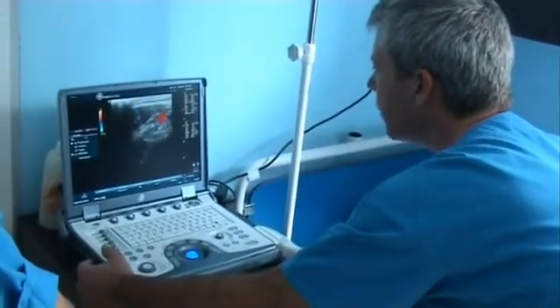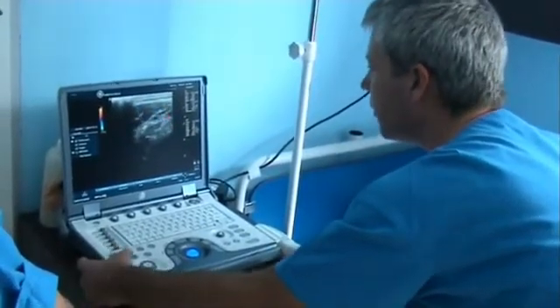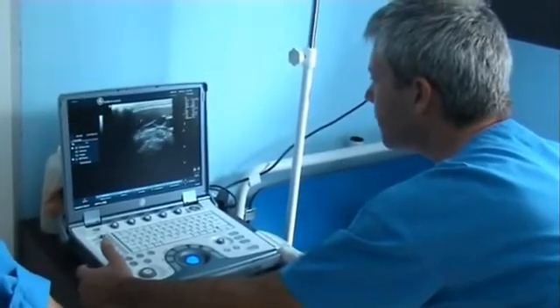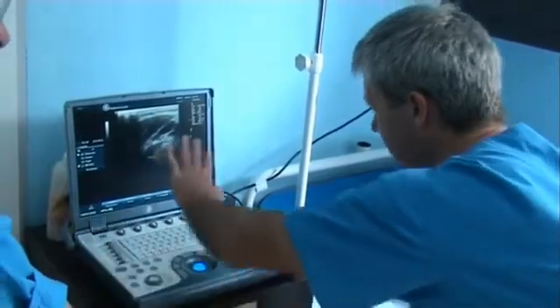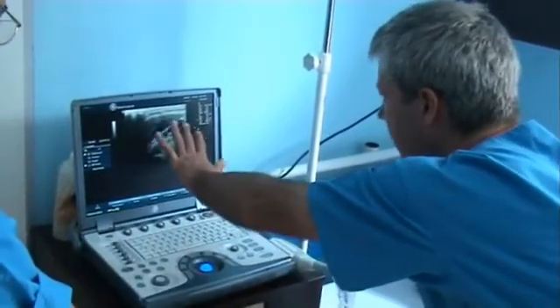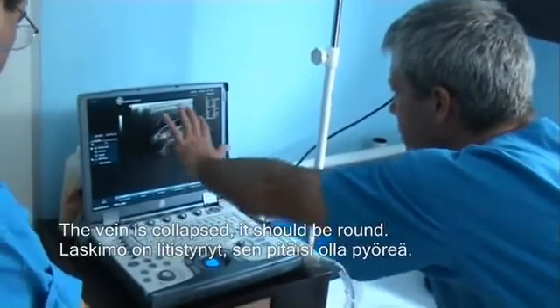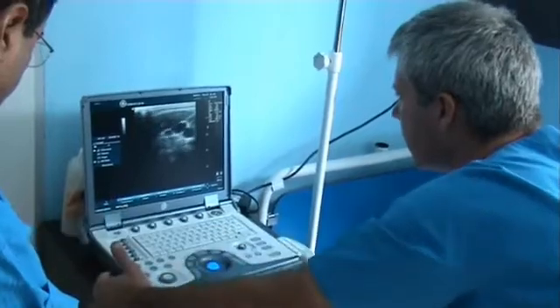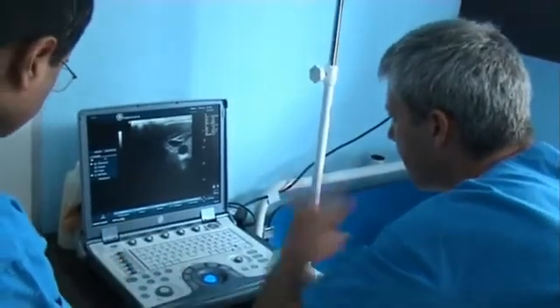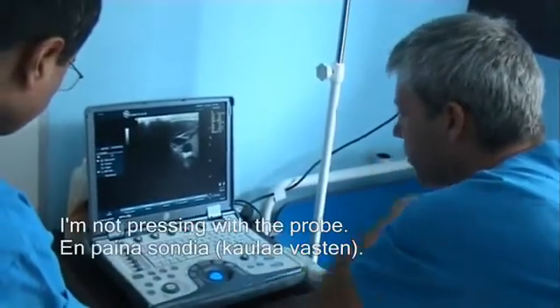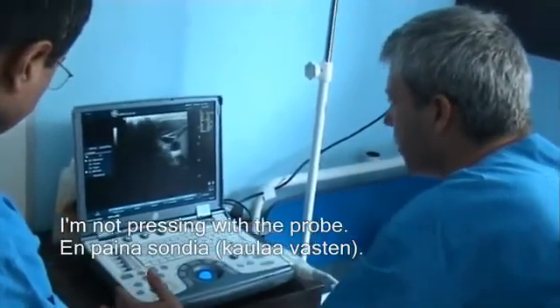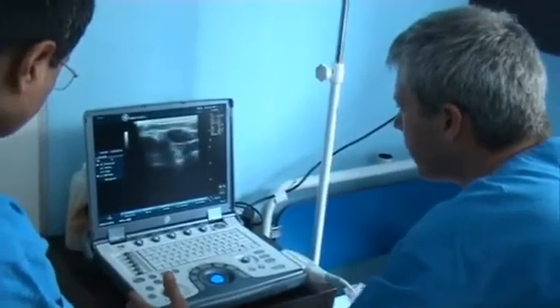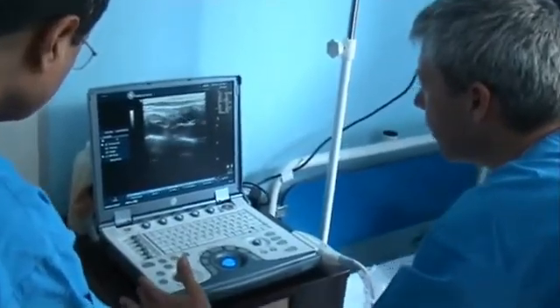So on the left side, the vein is collapsing here. It should be round shape, but it's flat. It's not here — I'm not pressing with it.